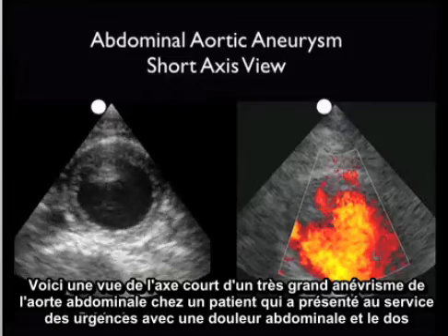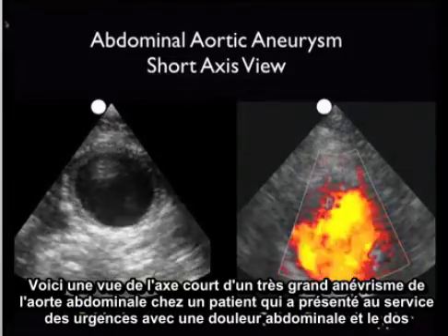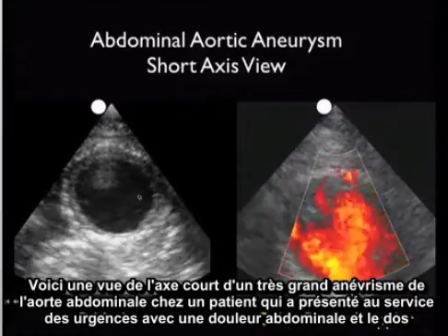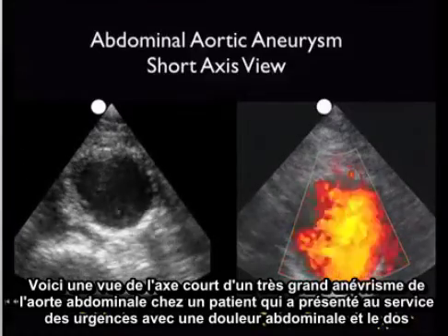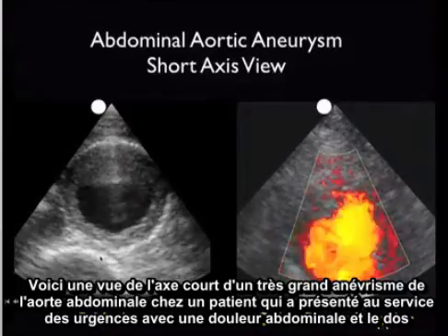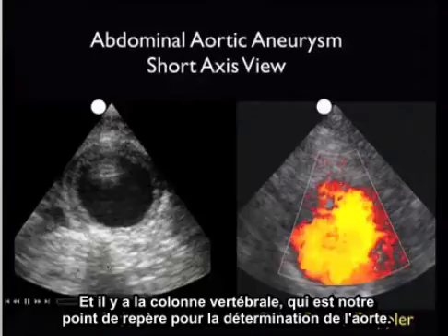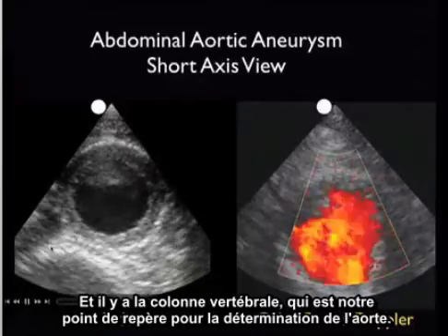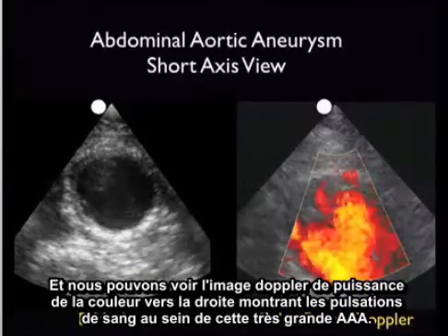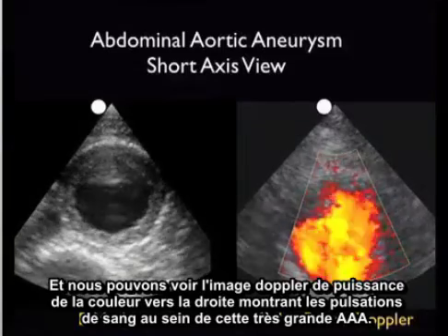Here's a short axis view of a very large abdominal aortic aneurysm in a patient who presented to the emergency department with abdominal and back pain. With a small indicator arrow, I'm showing in the B-mode image towards the left the large triple A, and there's the spine, which is our landmark for determination of the aorta. We can see the color power Doppler image towards the right, showing pulsations of blood within this very large triple A.